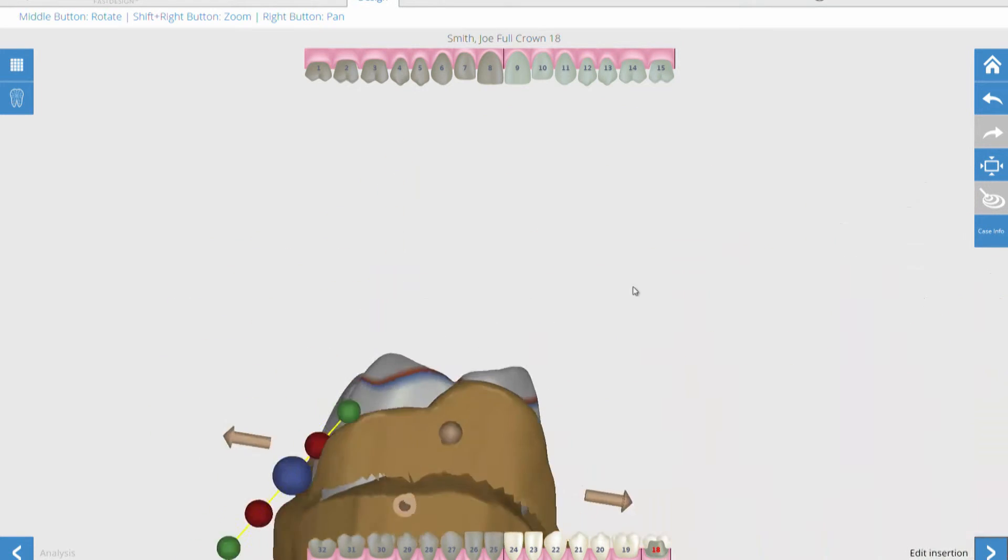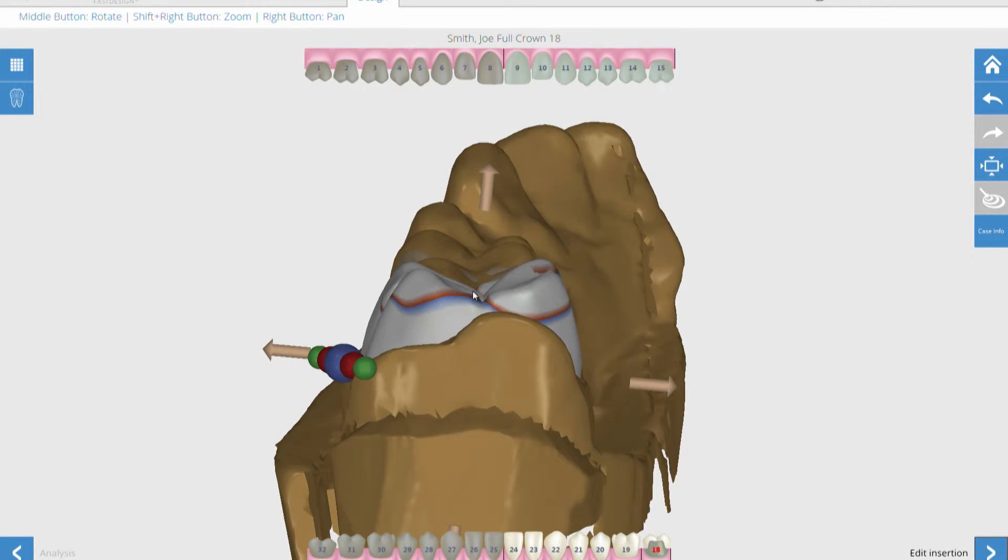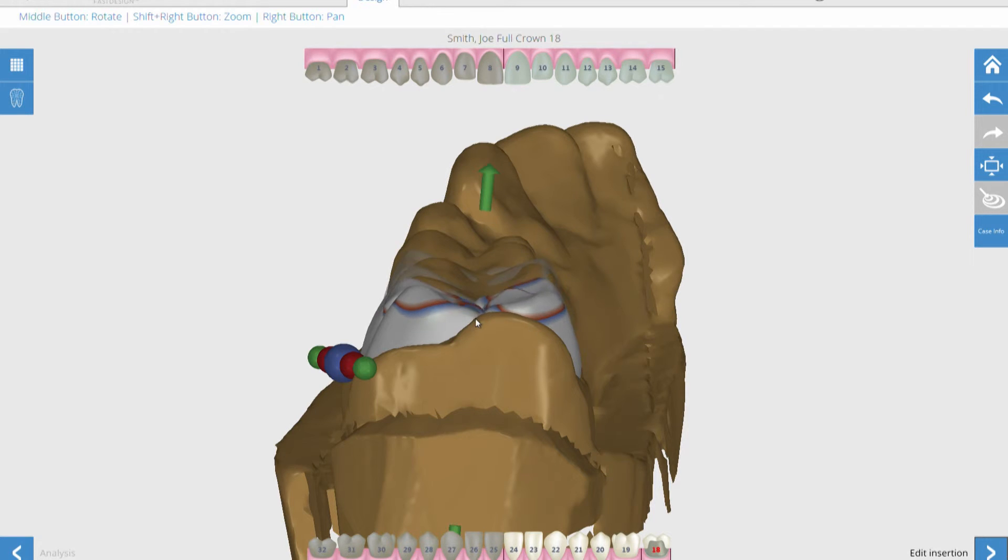The software provides multiple tools for the operator to easily manipulate the occlusal, lingual, or buccal surfaces in any direction.